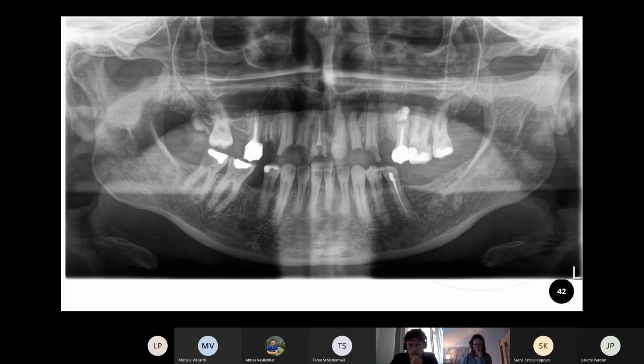Number 1, you can also see that it's endodontically treated. The treatment looks okay, but there's just caries everywhere. Then number 5 is extracted, number 4. Number 5, again, root canal inlay, and about this white stuff at the apex, I'm not sure what it is. Maybe it's been overfilled in the endo treatment. Maybe it's something different.